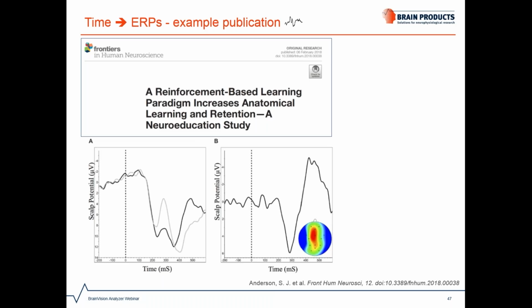Please note, this publication and following ones are examples only for cases where Analyzer was used. They are not selected based on any other criteria, and I'm sure you will come across many more papers when you do your literature research.